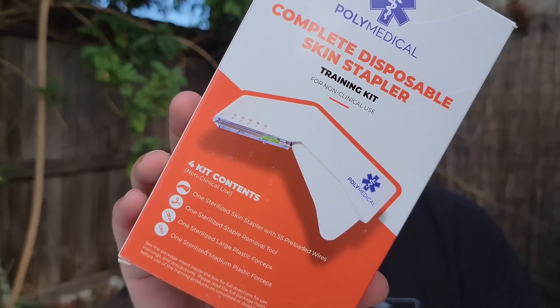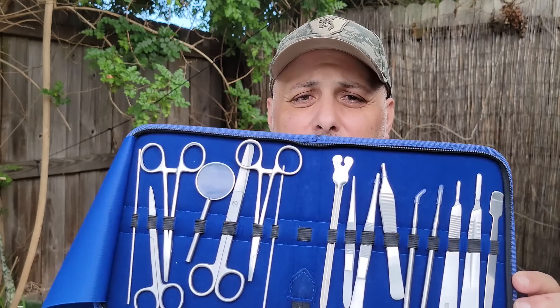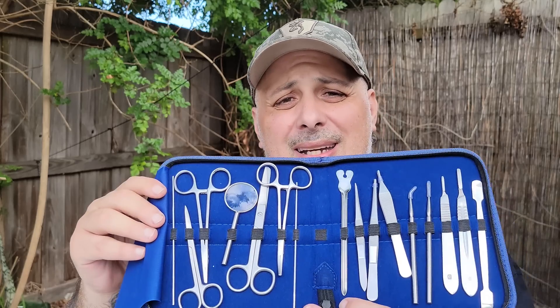This kit has a lot of different things in it. You have one sterilized skin stapler with 55 pre-loaded wires, one sterilized staple removal tool, one sterilized large plastic forcep, and one sterilized medium plastic forcep. They also sent me this little kit here — more of a surgical forcep kind of kit — with blades for scalpels and various other equipment like forceps that can be useful.